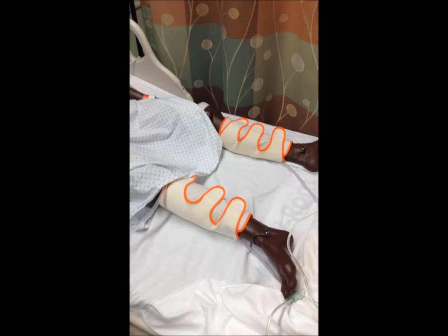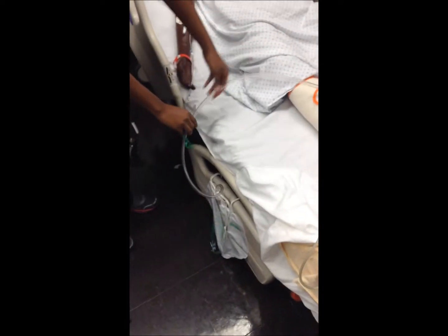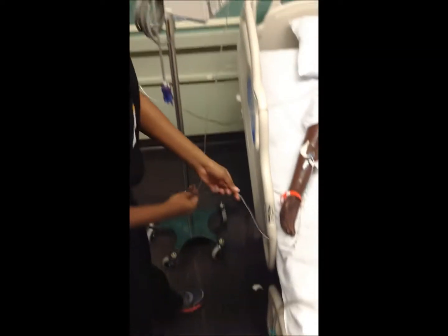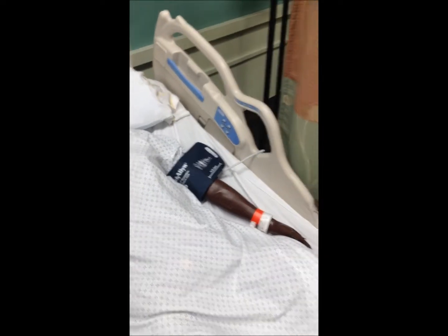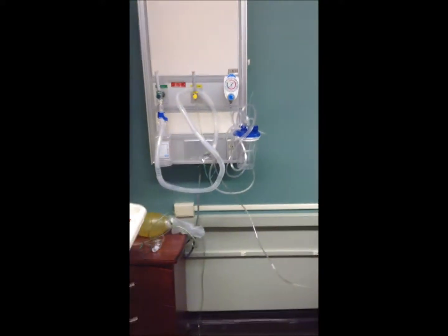First we have SCDs, which prevent clotting in the legs. We also have Foleys, which are shown here, and they're connected to the bed frame. We also have an IV, which can be connected to the IV pump. Can be a blood pressure cuff, which would be attached to a machine, and there's also oxygen, which can be attached to the oxygen machine.